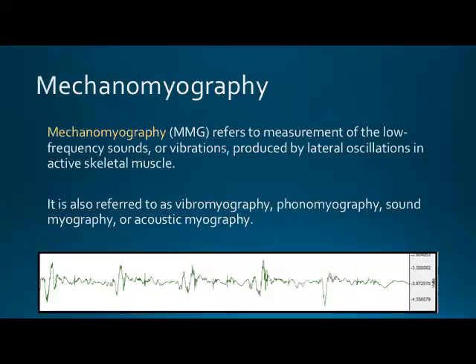If you look at a cycling signal, cycling is a series of concentric and eccentric actions, right? Shortening and lengthening. So this is not at the beginning of the action, so we can't differentiate any kind of gross lateral movement, but we see a lot of those dimensional change oscillations, which is basically what this is reflecting. We don't have any resonant frequency because you're always doing some kind of movement.